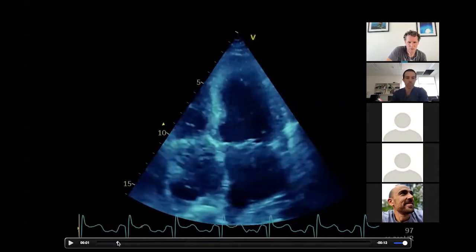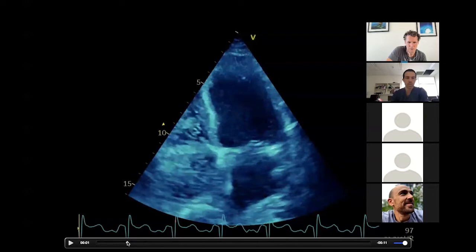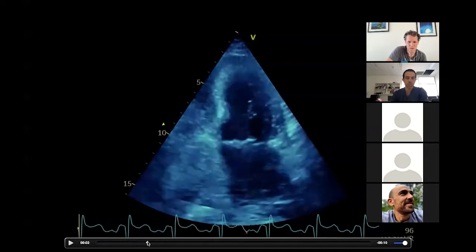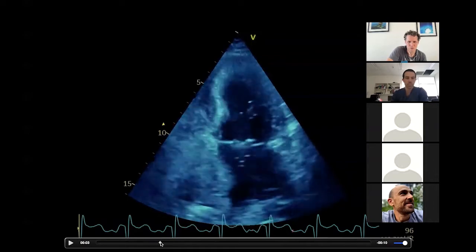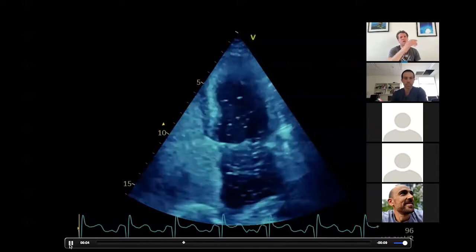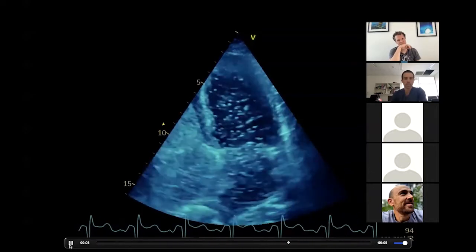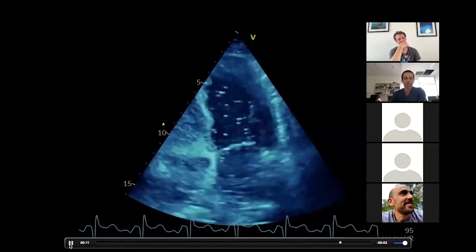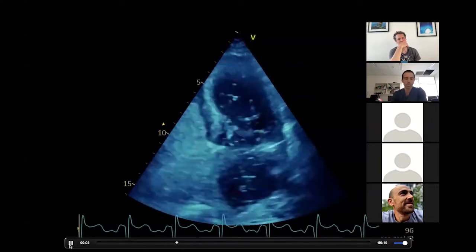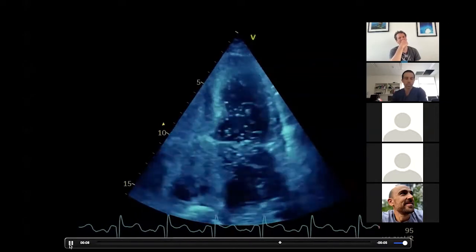So that's coming in there. Okay, so I'm looking at the red marker at the bottom now. So that would be 1, 2. Yeah, that's coming. 3, 4. So it's definitely coming in within 4 cardiac cycles. This is definitely patent foramen ovale, probably because of the hypoxia and the ARDS, which the patient has developed subsequently, with bubbles of the contrast appearing onto the left side across from the right atrium.